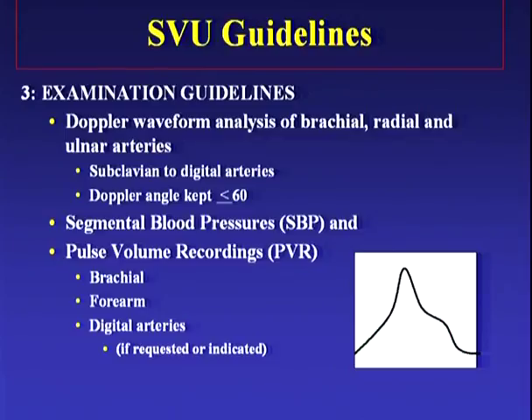and take in the brachial region too, to come up with an assessment of whether there's a problem between the cuff at the brachial level and the forearm cuff. And of course, we can also look at this with pulse volume recordings.